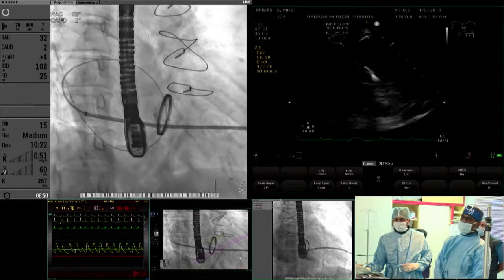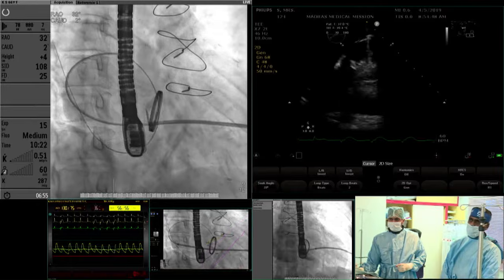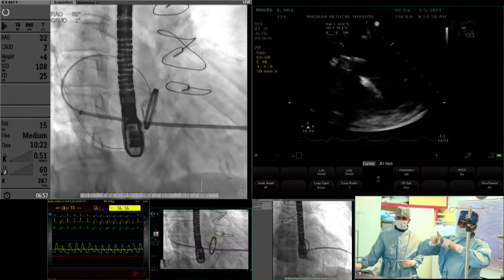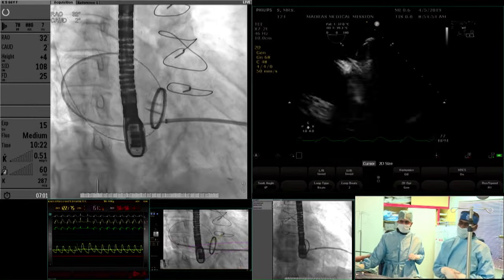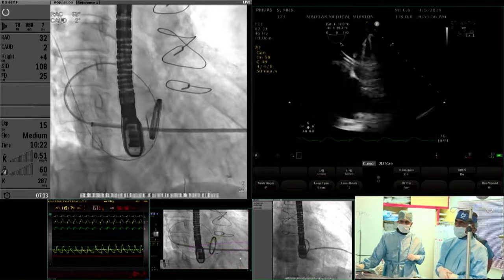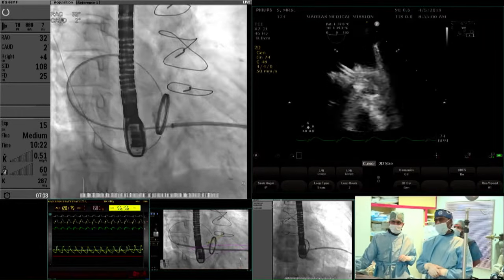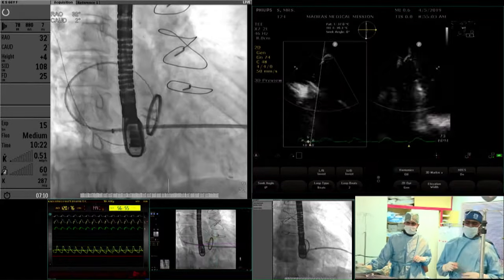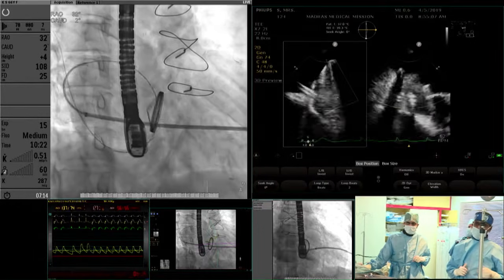Yeah, the reason why we did not choose an AVP3 was the largest AVP3 is 14 by 5. The 14 on the long axis will be good, but the 5 on the short axis will not be adequate. If you are using an AVP 14 by 5, then we probably have to stick in another device as well. We are trying to do it with a single device, if possible with an AVP2. Yeah, as you said, a muscular VSD device is also another option.